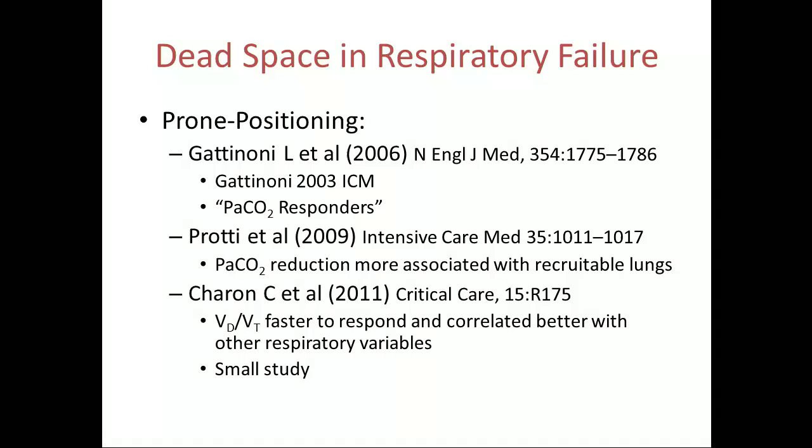So finally, I'm just going to touch upon a few other ways that dead space can be used in respiratory failure. It's been used as a marker in recruitment studies and prone positioning, and several of these studies have found that people in whom PCO2 falls following either recruitment maneuver or prone positioning are more likely to, number one, probably go on to survive. So those patients who are PCO2 responders, i.e. in whom there's an improvement in ventilation, have a better response to prone positioning.